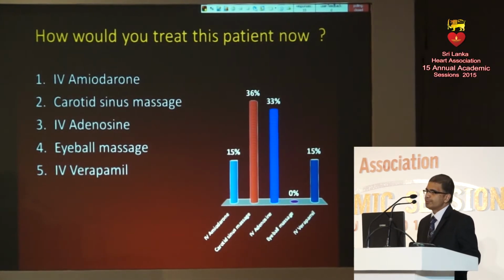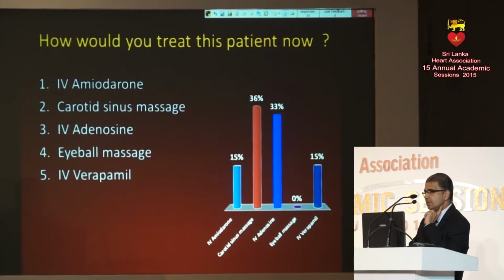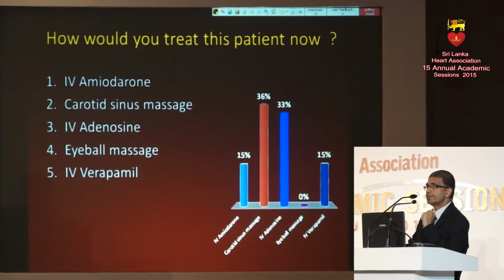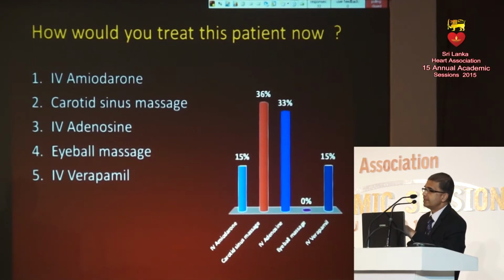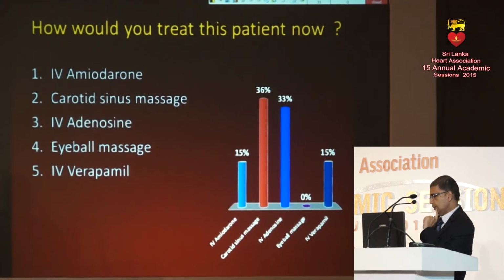We have very few votes, but still the majority of people suggest either a carotid sinus massage or IV adenosine, right? Nobody says eyeball massage, which is of course very good, because though eyeball massage itself will terminate the tachycardia, it has now been discontinued because of the various dangers probably. So let's see the answers.